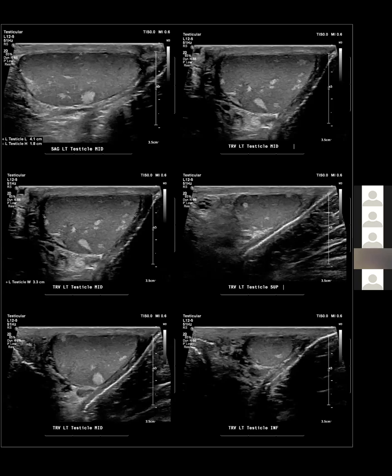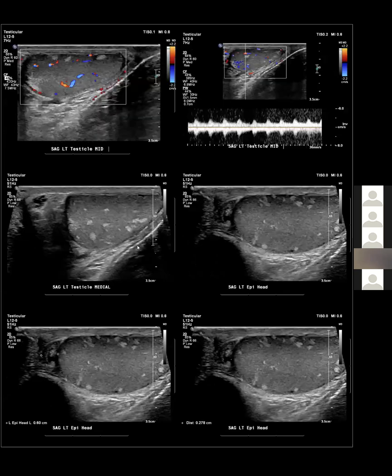Okay, so we have... Have any ideas? Umar is asking hamartomas and Cowden's disease. Yes. So these are multiple testicular hamartomas, usually symmetric bilateral. I actually did a literature search on this. I couldn't find anything specific as a pathologic correlate.